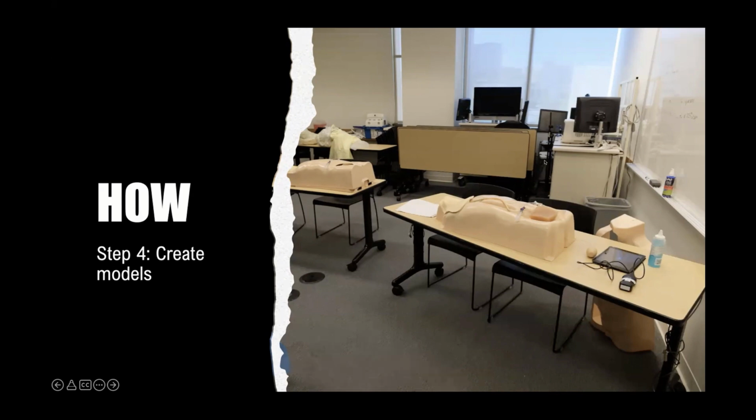That's okay. So then next we had to create the model. I worked with Bob and Vanessa in the Sim Lab, who are part of our team there, and they have ample experience in regards to creating these models. And so they were so instrumental in regards to determining what type of gels we should use, how we could make the nerve, artery, and vein as realistic as possible.